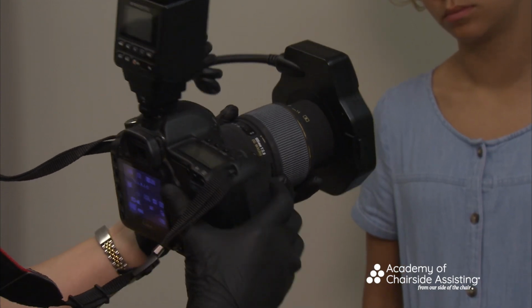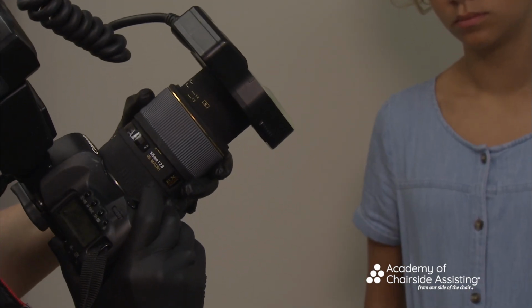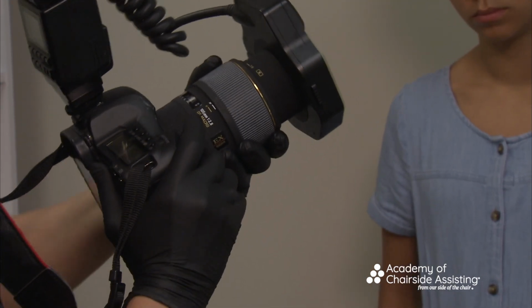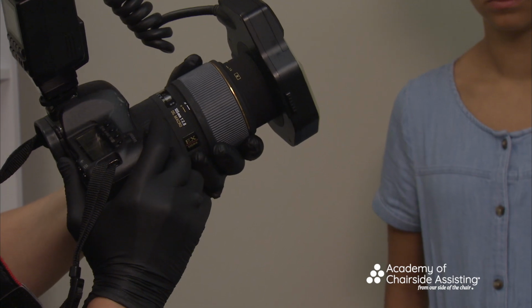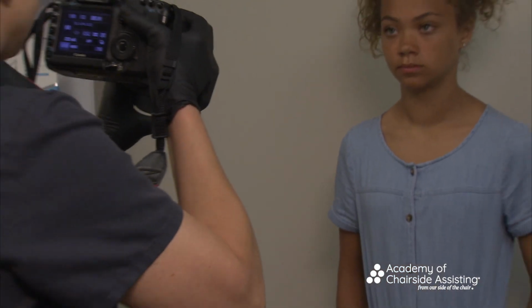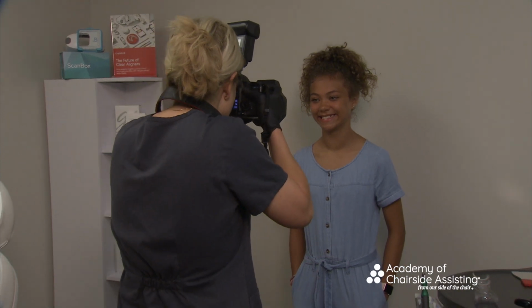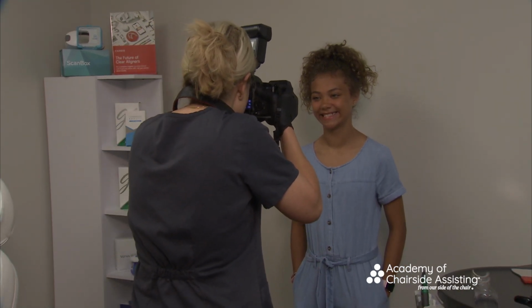As we go, I'm going to hit my button again to make it live. We changed it to 32. Now I want to make sure I didn't move anything. The other thing about some of these cameras is we actually can lock it, so you can't really move it. And that's what I would suggest you do. So Kylie, I'm going to come in, and I want you to give me the biggest smile, big smile, and say just like that.